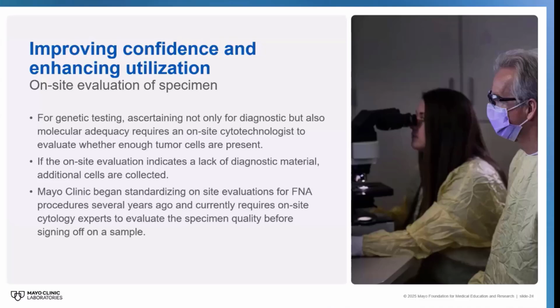And so they are able to give that feedback right to the procedurist to say, I need more slides, or please collect a couple extra passes so we can put it into cell block for more workup. And hopefully this builds that camaraderie, that we're all doing what we can to produce the best testing options for the patient.